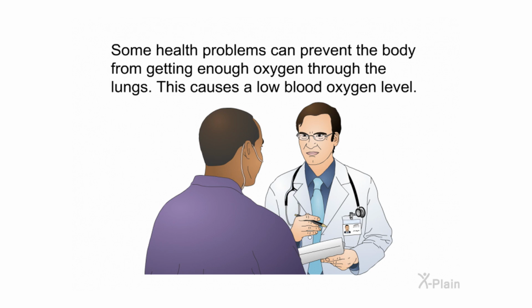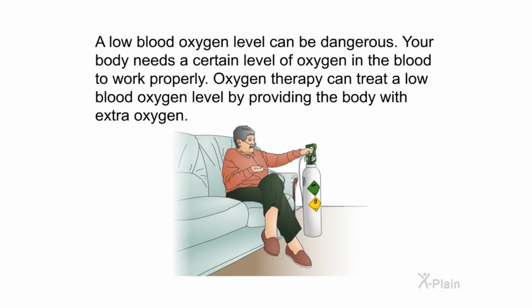Who needs it? Some health problems can prevent the body from getting enough oxygen through the lungs. This causes a low blood oxygen level. A low blood oxygen level can be dangerous. Your body needs a certain level of oxygen in the blood to work properly. Oxygen therapy can treat a low blood oxygen level by providing the body with extra oxygen.